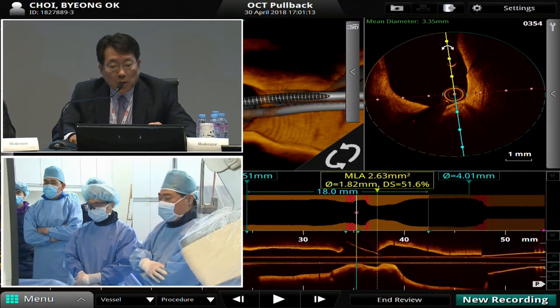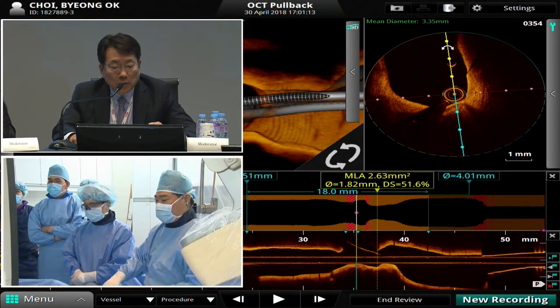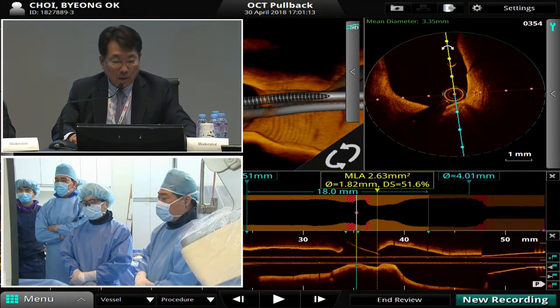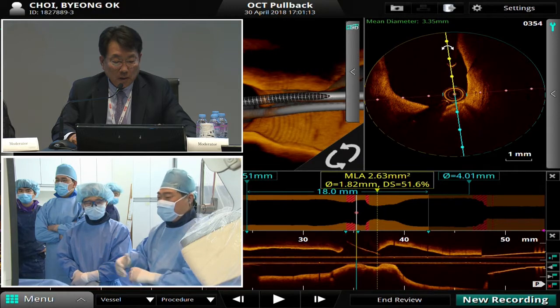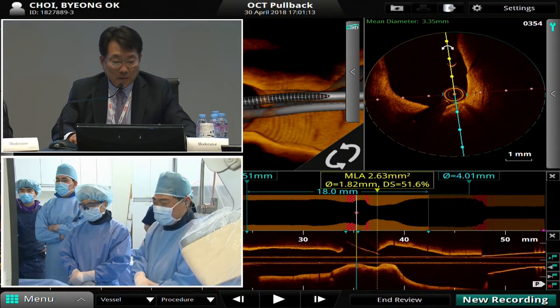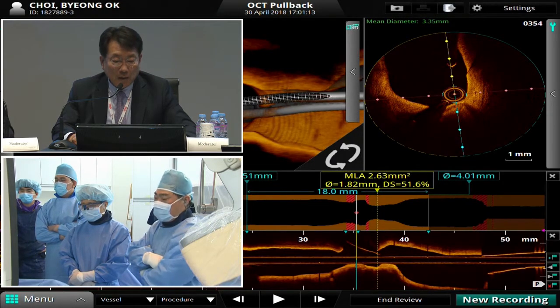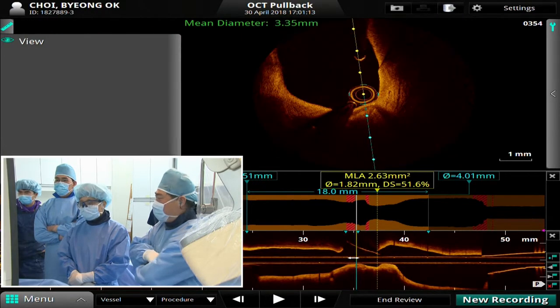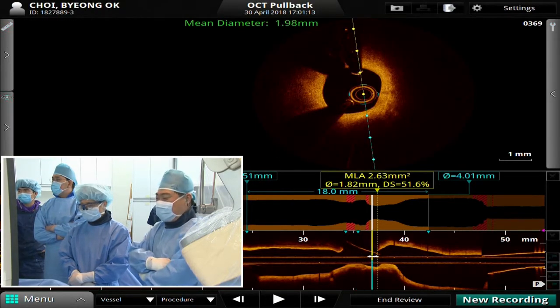So, why don't you do that? You want to move? What did you do, Dr. Kim? Direct stenting. Why not? I recommend direct stenting. All right, great. Recommended by the OCT.